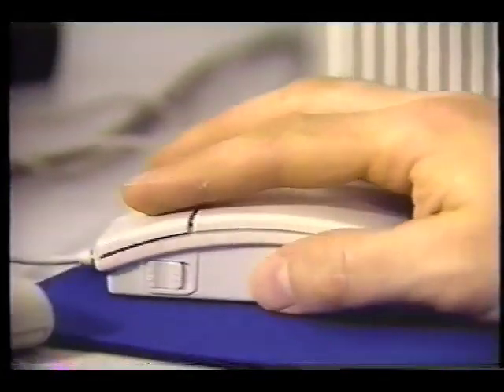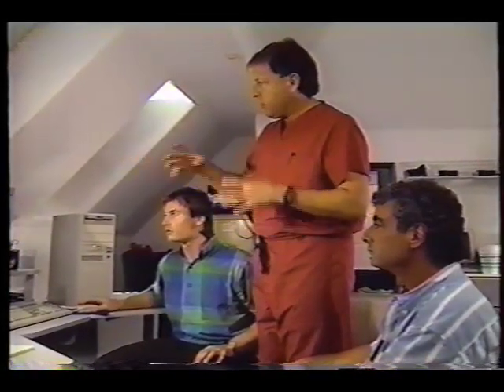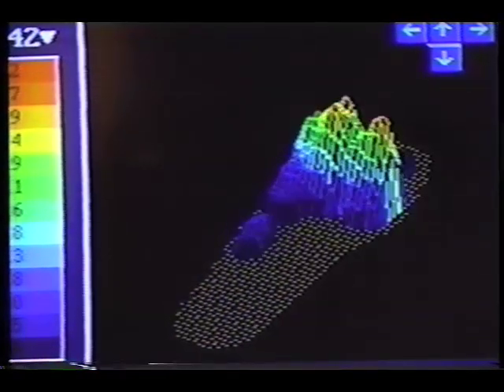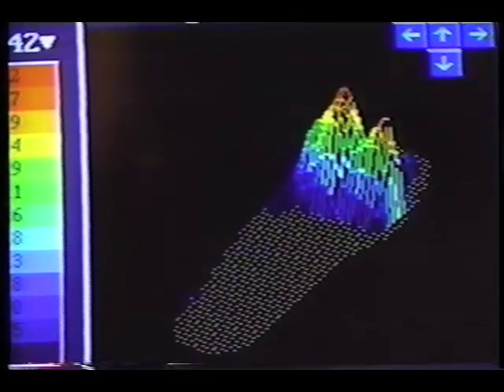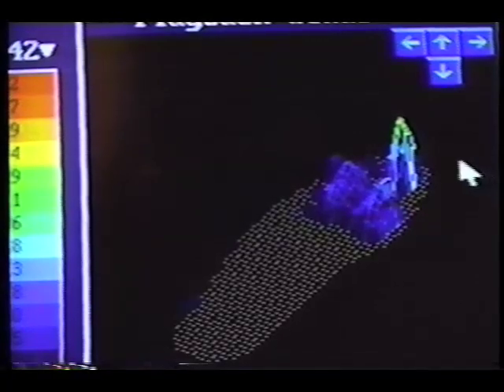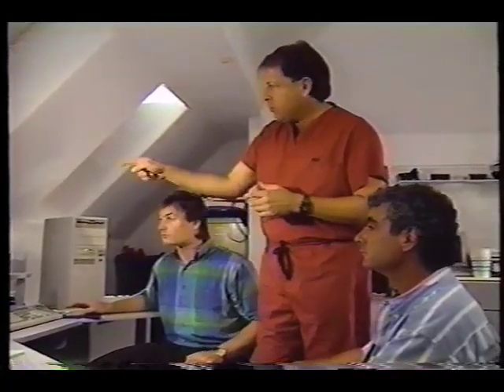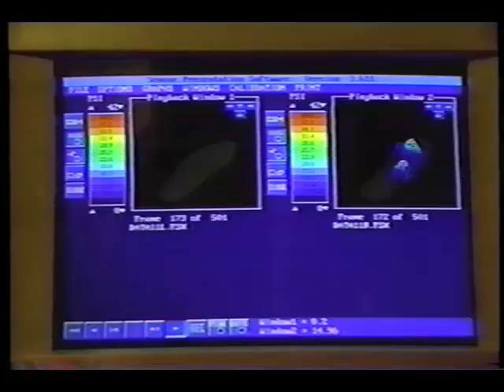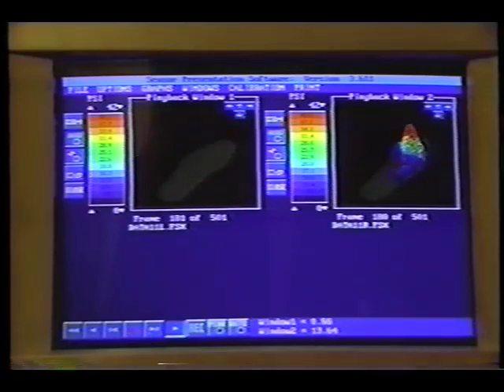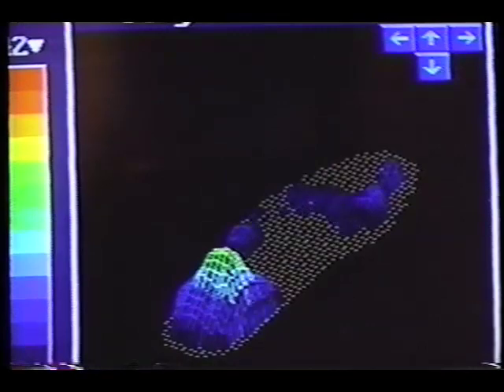Okay, now Norm, what we see here is the summation of all the pressures on your feet. The red spots are where you have the most pressure, and the other lighter colors are less pressure. And what's important here is you can see a couple things. One, you're bearing a lot of weight on your big toe. You're supposed to bear weight back at your big toe joint, but you're grabbing with your big toe, and the reason you're doing that is because your joint isn't working right. And it's actually on both feet that you're doing that. You're not getting enough weight on the big toe joint back here. So when I get done with this, I'm hopeful we'll bear more pressure on that joint so that when you walk forward, the weight is distributed evenly across the ball of your foot.